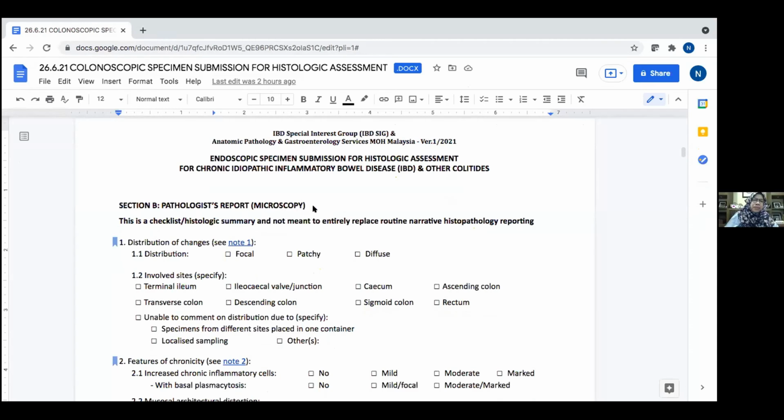Okay. Crypt apoptosis. You're saying crypt apoptosis or apoptotic crypt abscess, and conventional crypt abscess. Okay. So for the conventional crypt abscess, you see neutrophils live and healthy.